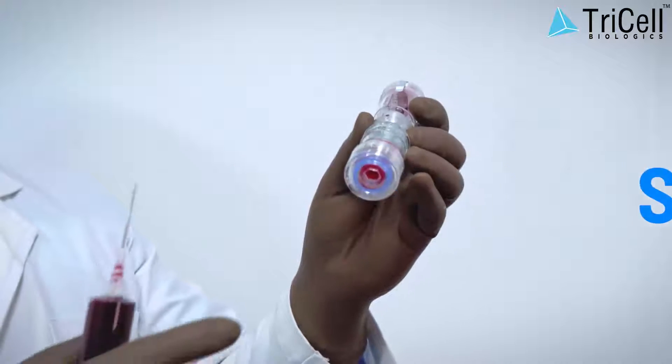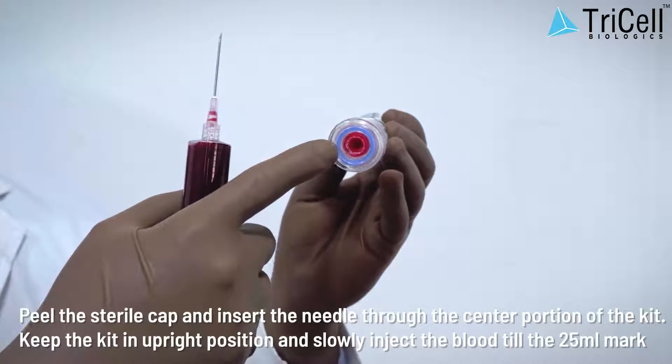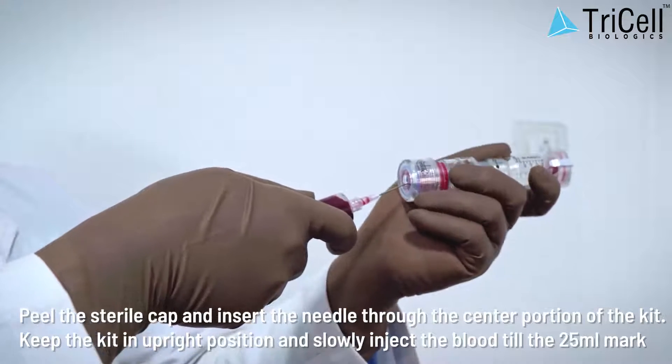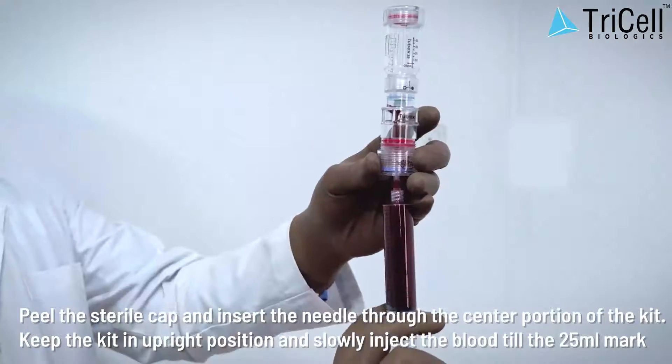Step 3: Peel the sterile cap and insert the needle through the center portion of the kit. Keep the kit in an upright position and slowly inject the blood till the 25 milliliter mark.